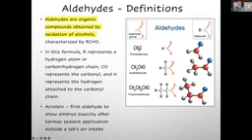You'll find those in almost all environments, both outside and inside. The one that was first described as having been shown to have embryotoxicity, and that was shown in the human as well as in the mouse, was after tarmac sealant was applied outside the lab's air intake in the northeastern United States. And that was published by Jerry Hall in 1998 with the team of Antonia Gilligan. And we were also involved placing filter systems in that lab to turn things around. And quickly, there was a tremendous inhibition of pregnancy, but it quickly turned around.